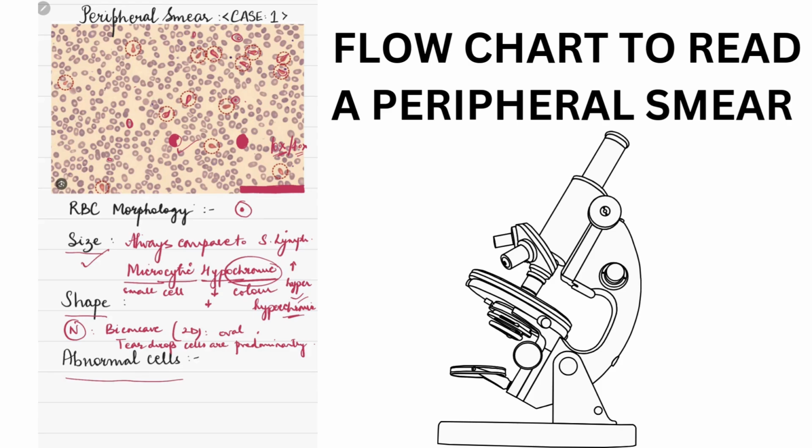There will be hemoglobin in the center, then a pallor area, and then another rim of hemoglobin, like a bullseye. Cells will be arranged like this. Size will be okay, but there will be a central dot of hemoglobin, then pallor, and then hemoglobin. Here, like this, central red color, and then this whole area will be white. I'll explain it in the next slide maybe.